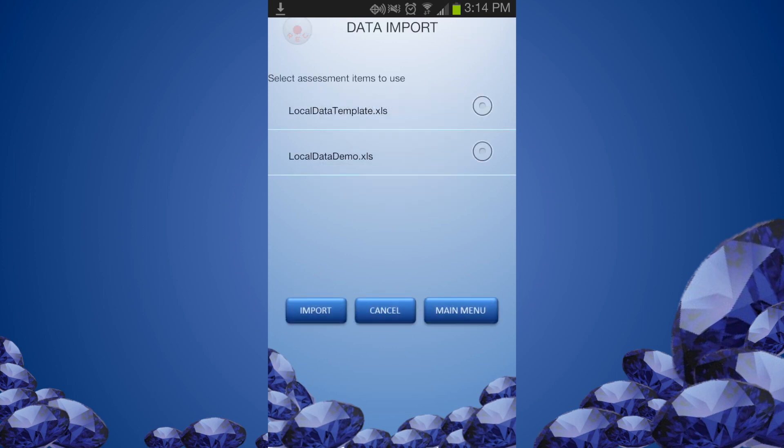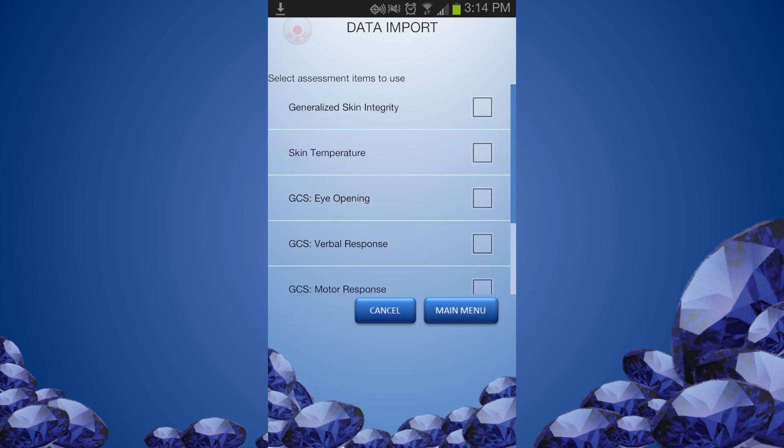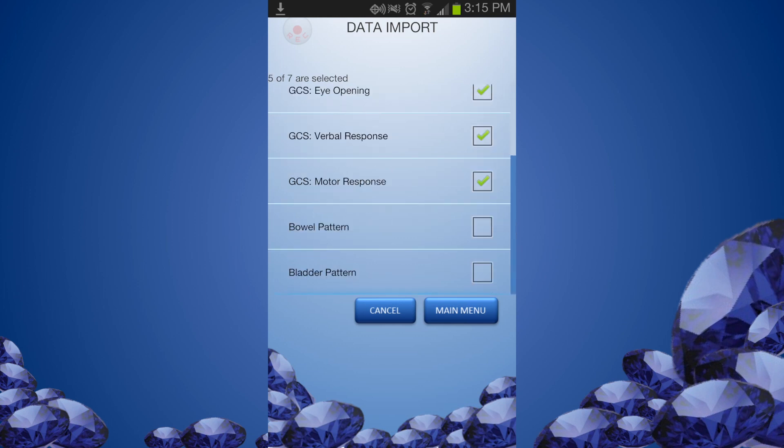Click Data Import and click Local Data. Select the data file you want to import and click Import. The imported assessment items are listed in this screen. Select the items that you want to use.